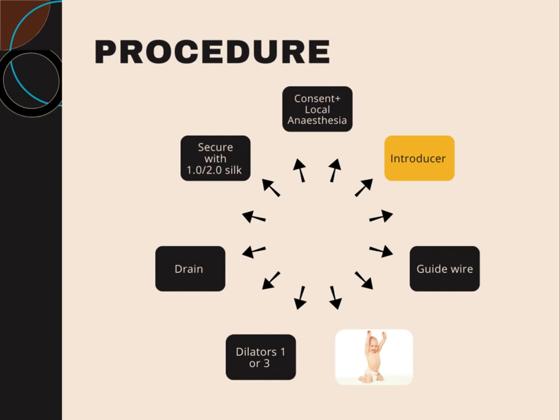And the dose for lignocaine would ideally be 3 milligrams per kg body weight, so we can just measure it, and then we can insert. I think the procedure is a bit technical.